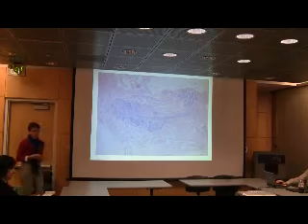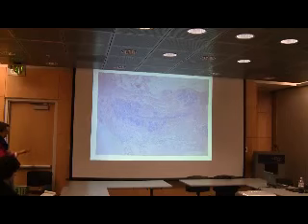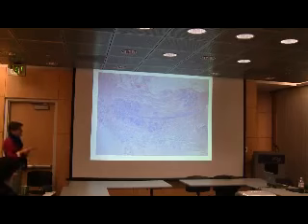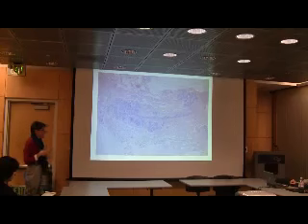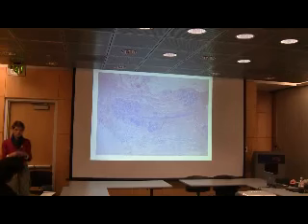Yes? Okay, so here, I think it's my last normal slide. And this I thought was a particularly beautiful example of a duct leading into a lobular structure. Here is one that's disconnected, and this probably comes off of the little side branch right here. Now, it's pretty rare to be able to happen to cut it this way. Mostly, I would say 95% of the time, all you see is disconnected lobules and small ducts.